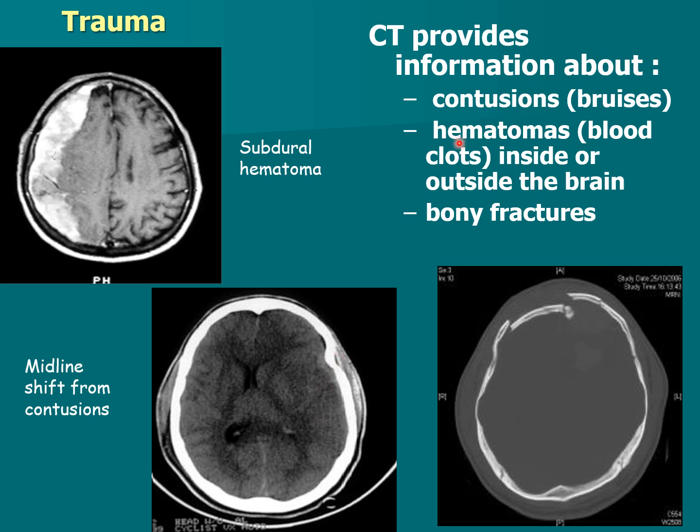Hematomas, blood clots, we can see this subdural hematoma here going along here, inside or outside the brain. We could see an epidural or subdural, or inside the brain. And also we can see the bony fractures. Now, there obviously is going to be brain damage here, but we don't do skull x-rays on many of these patients because we can already see the fractures, and then we can do a 3D reformation to see the cranium in a better fashion than you could with general skull x-rays.